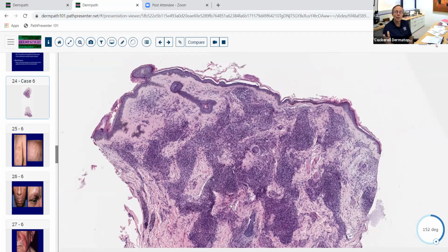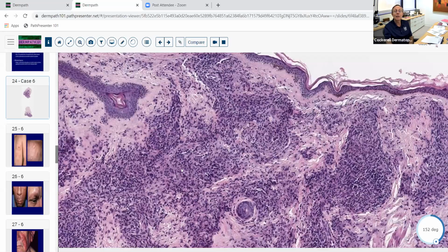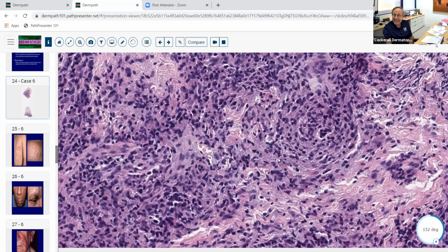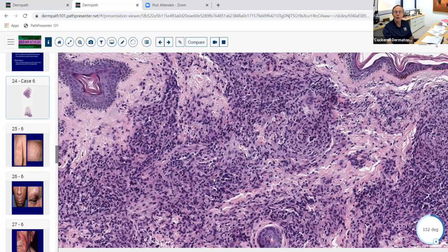If it's nodular and it's also got maybe a band-like infiltrate superficially, a lichenoid plus nodular, you might want to think about syphilis, something along those lines. If it's purely lymphocytes just around blood vessels and it's nodular, that favors one of the lymphocytic infiltrates. We know there's about 8 or 9 of those. So as we go to higher magnification, you can see that a lot of these cells are pale, admixed with the lymphocytes, histiocytes here. So this is a lymphocytic and histiocytic infiltrate.